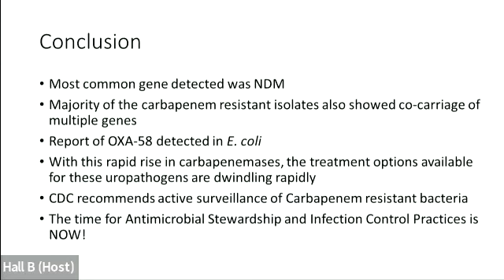Conclusion: the most common gene detected was NDM. The majority of the carbapenem-resistant isolates also showed co-carriage of multiple genes. OXA58 was detected in an Enterobacterales isolate. And with this rapid rise in carbapenemases, the treatment options are becoming limited day by day. The CDC recommends active surveillance and following infection control practices to control the spread of carbapenemases in various hospitals. Thank you.